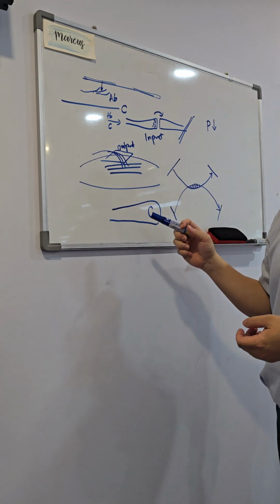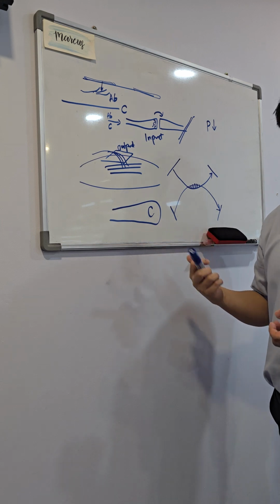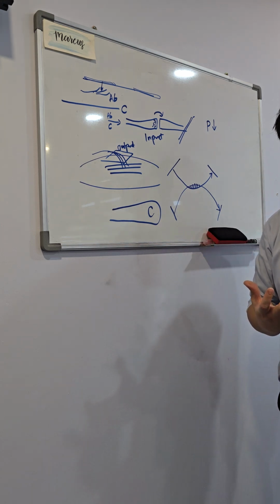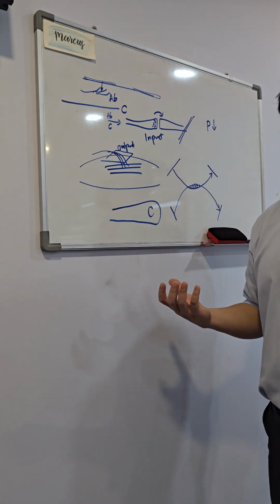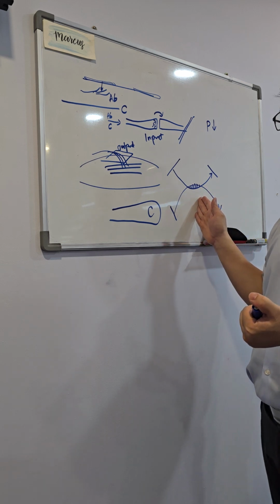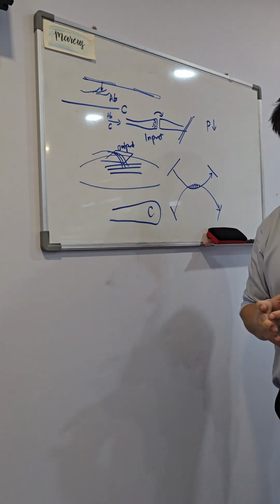I think C fibers is only a crude thing. I think we'll also stimulate other things because patients generally feel a little bit of warmth deep inside the joint as well. But it's electricity, so what is it stimulating? Any fibers, all right? So this then allows for a more targeted approach to a deeper structure.